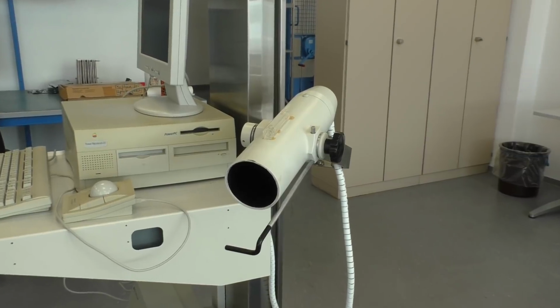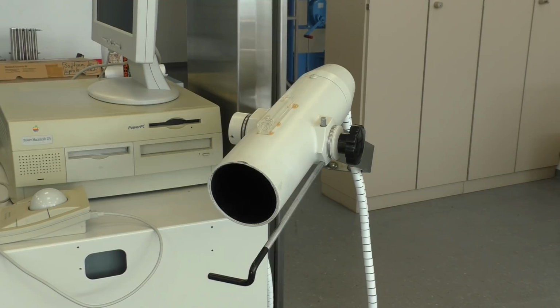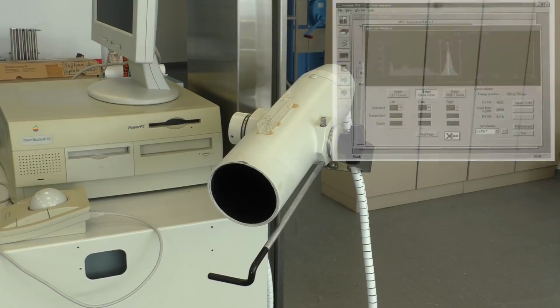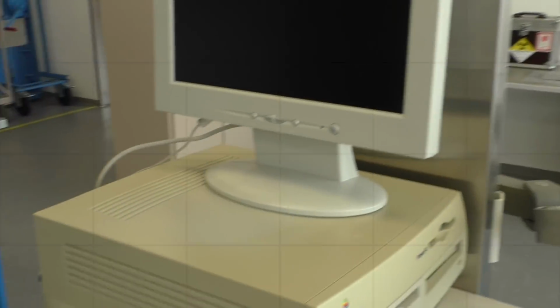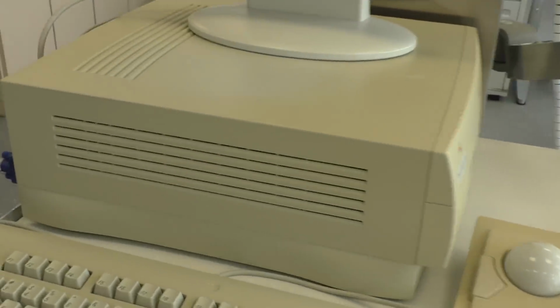And it's not only to measure how much radiation someone got, it also can differentiate the kind of radiation. So in the end it's a spectrometer, and you can say what radioactive substance is active here. Let's turn this thing on, and then we can see on the screen what it can do. So let's first look at what it is.